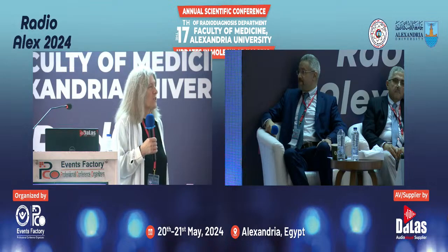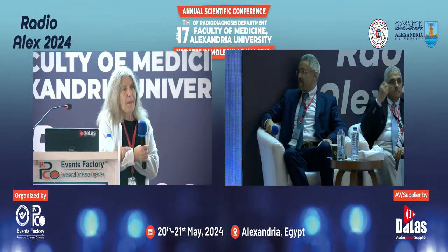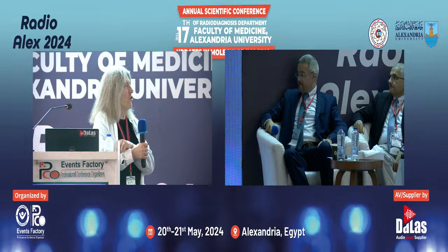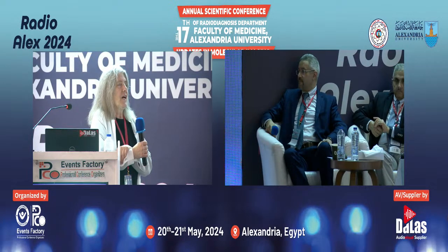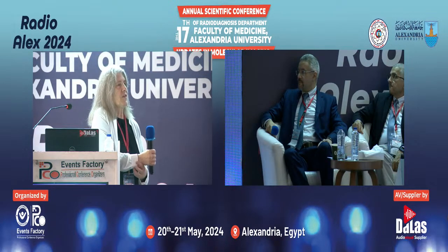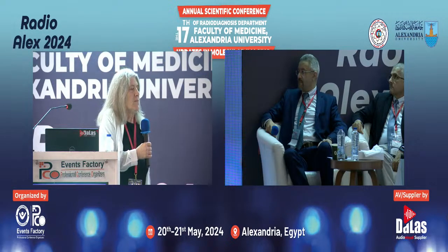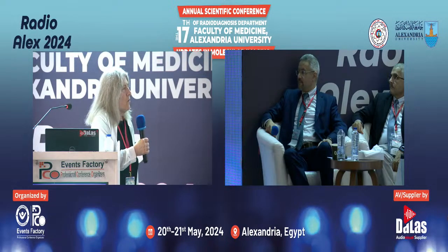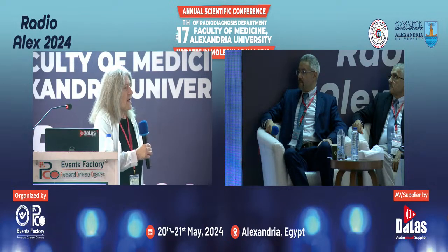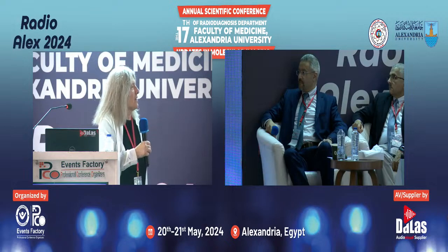Well, your first question was PET MRI, and what's the role of that? There's certainly an advantage in terms of radiation dose, no question about that, and it may be more important in children than adults. But if I look at the staging of pediatric malignancies and disease progression, what is typically used is CT and not MRI. Whole body MRI has a lot of potential, and yet children's hospitals typically do not use whole body MRI for assessing disease response. They do a low-dose CT with contrast.